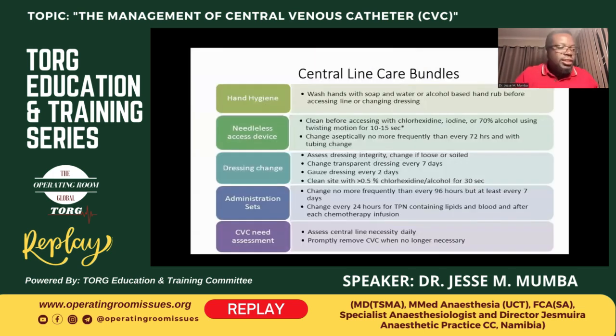So everything else that we've talked about today, if we were to sum them up, we normally refer to them as care bundles, central line care bundles. And they boil down to very basic things that can save a life. And that is hand hygiene, needleless access. Make sure you clean that access before using the central line with at least 70% alcohol containing solutions for 10 to 15 seconds.